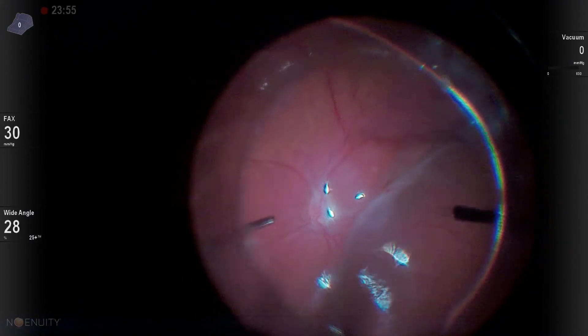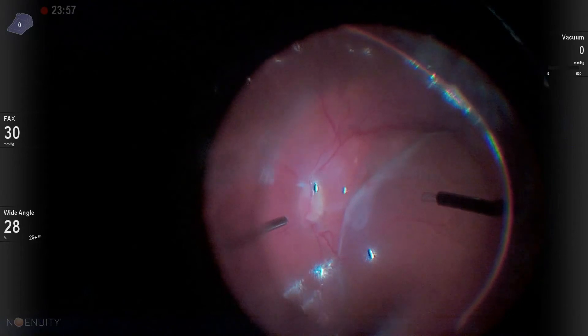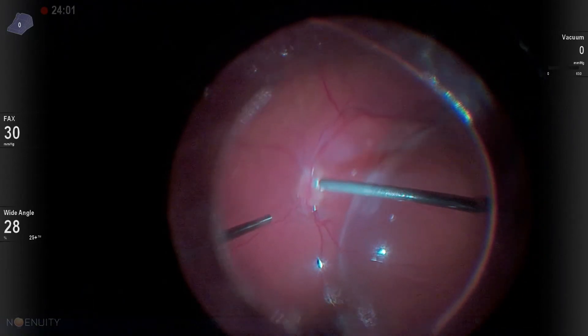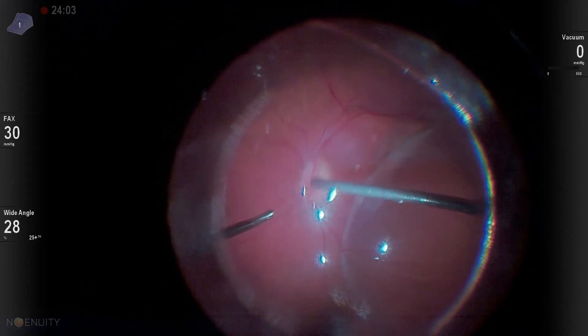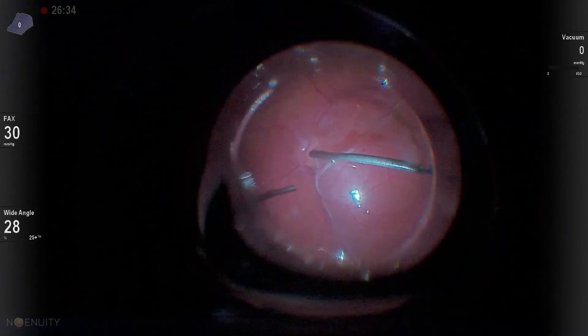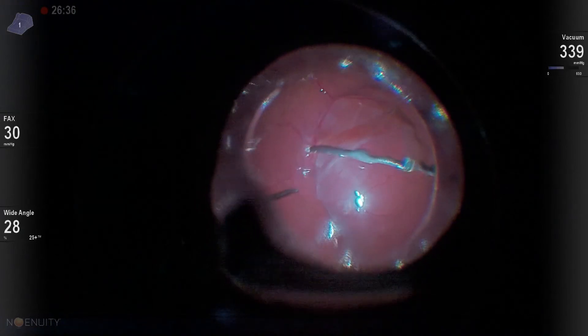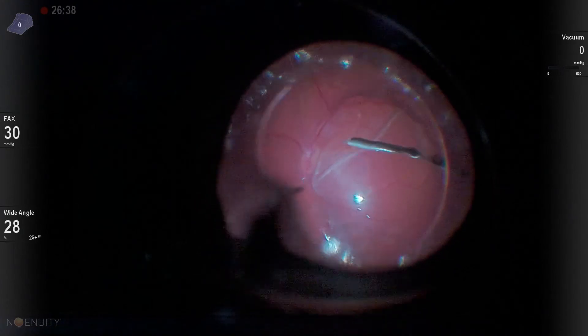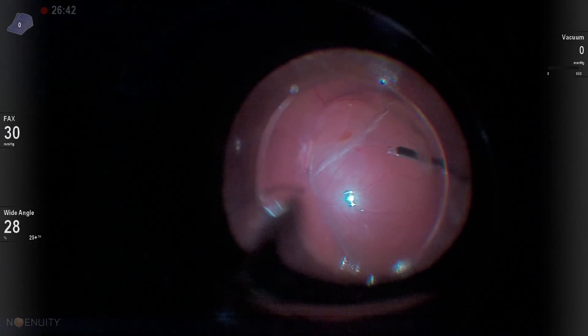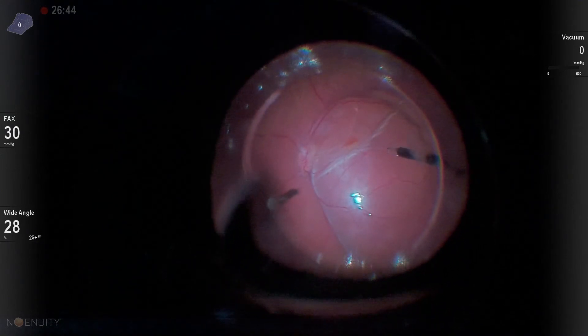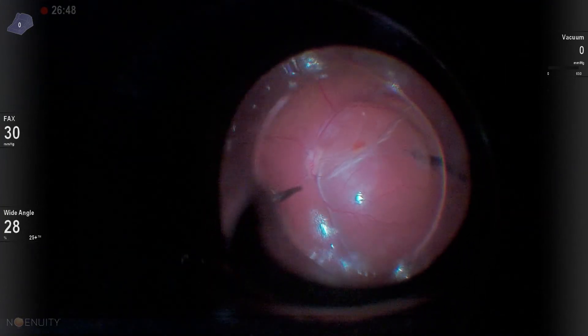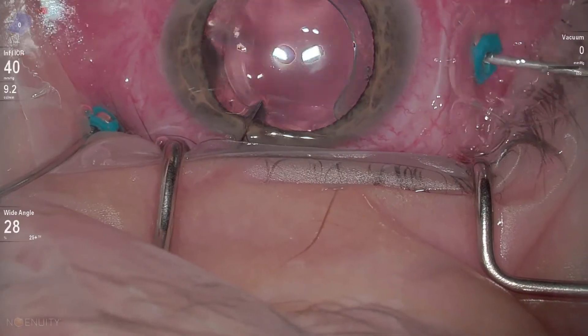And then we decide that we're going to put back in perfluoron, so we go back to fluid and re-inject perfluoron to try and help move and stretch the retina back into a more normal appearance, as we can see here. And we do this a couple different times, and sure enough, the subretinal fluid eventually does move across the macula and detach the macula and start to unfold that area.